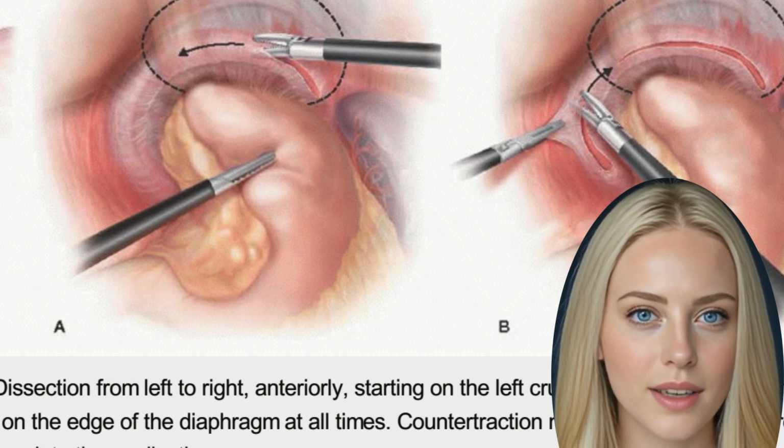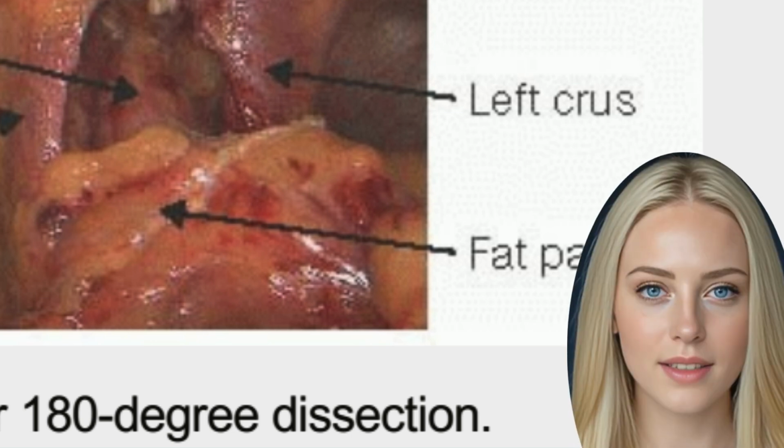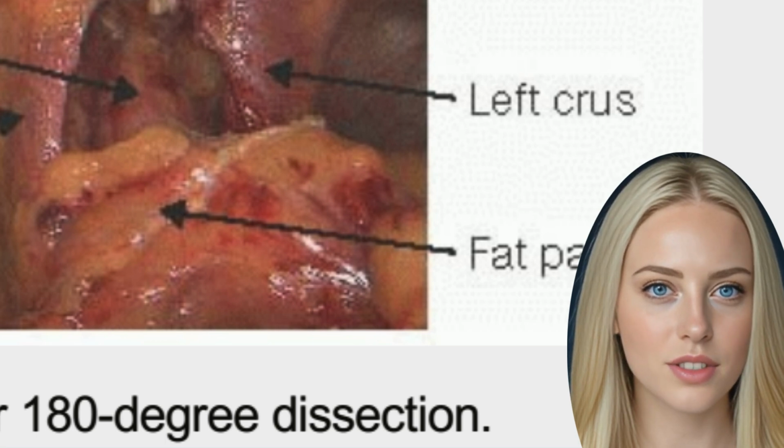3. A 5 mm right upper quadrant trocar, measured 7 to 10 cm from the supraxiphoid point and 1 to 2 cm inferiorly, for the surgeon's left hand. This can be placed to the right of the falciform and then through the falciform.